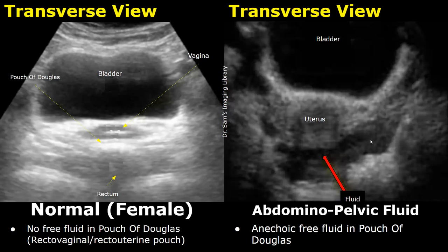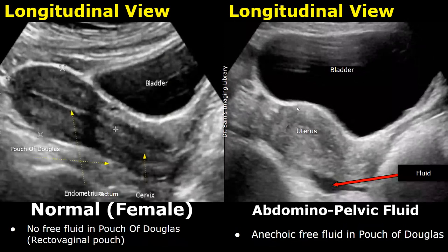In a trauma patient, you can also examine the pelvic region in a longitudinal view. Here we see no fluid behind the uterus, and over here we can see some anechoic fluid in the pouch of Douglas.